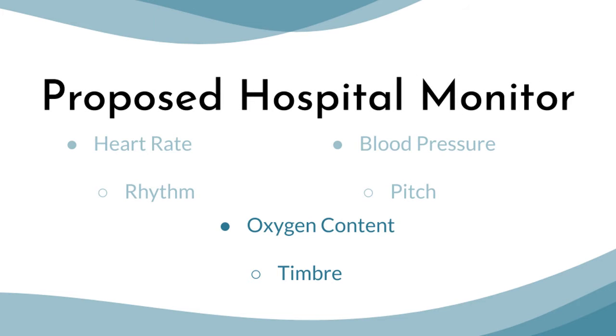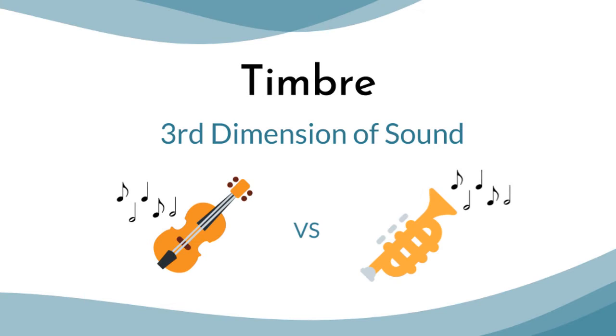The new proposed monitor audio would sonify 3 vital signs: heart rate, blood pressure, and oxygen level. Oxygen content will be portrayed as timbre. Timbre is the third dimension of sound. It is what differentiates one instrument sound from another.